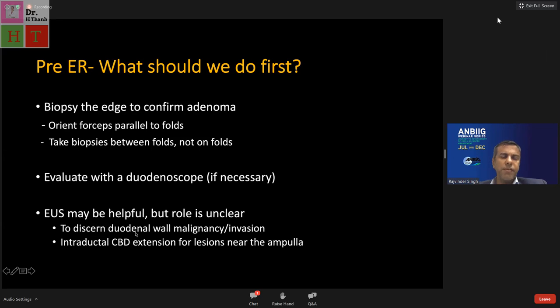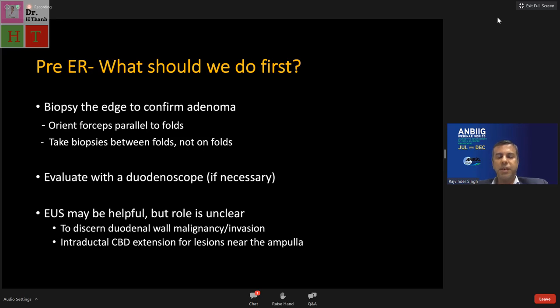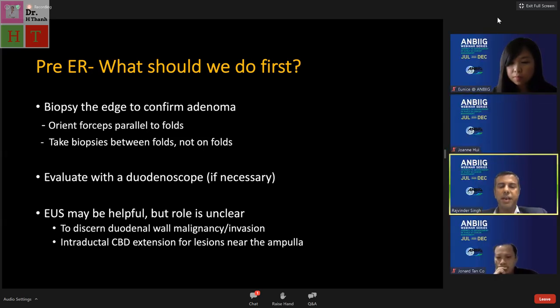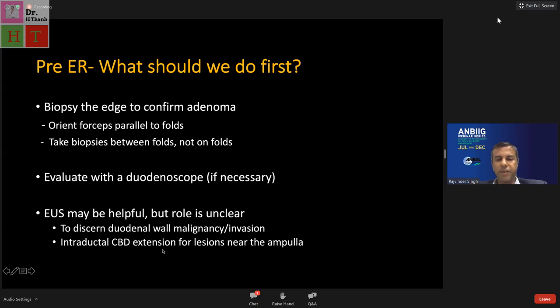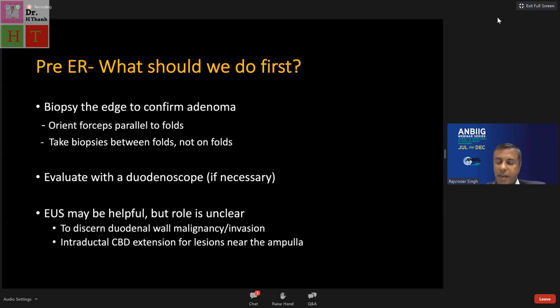Rapat nicely showed features suggesting more than adenoma: lesion beyond one centimeter, depressed component, reddish discoloration. For the ampulla, CBD extension can be assessed with EUS and MRCP. Predictors of malignancy include ulceration, depression, redness, friability, and reduced distensibility — applying the distensibility sign principle from gastric lesions to the duodenum.